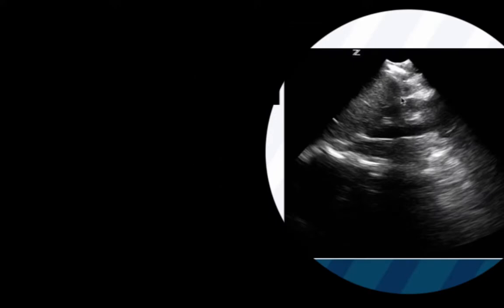Sometimes they can get in the way. So here we're trying to look at a kidney, but we get these shadows going through our image because of the ribs that are up here casting a shadow on our screen. So just because it's an artifact doesn't necessarily mean it's bad. We just need to recognize it and know how to incorporate that into the image that we're seeing.